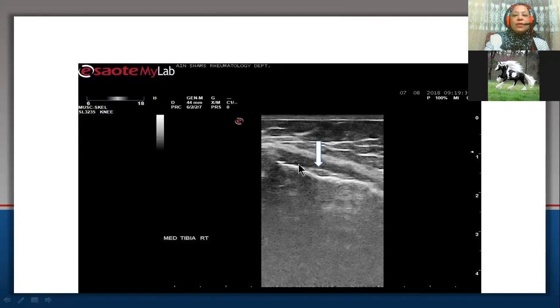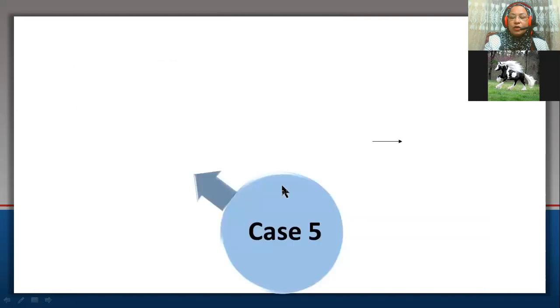So please don't miss this finding, especially in presence of severe tenderness on sonopalpation. Don't miss presence of periosteal elevation that may point to periosteal avulsion, underlying osteomyelitis, or periostitis.